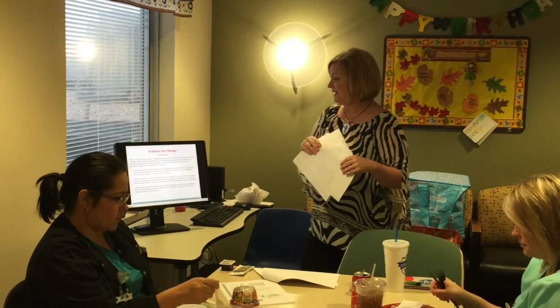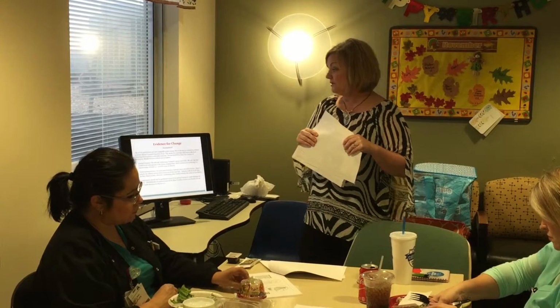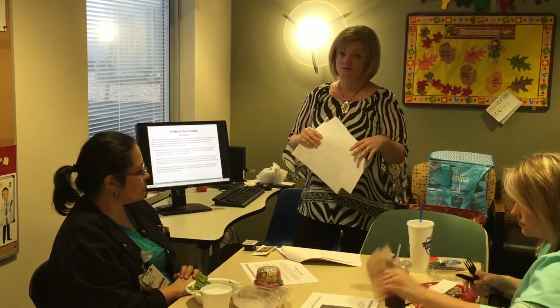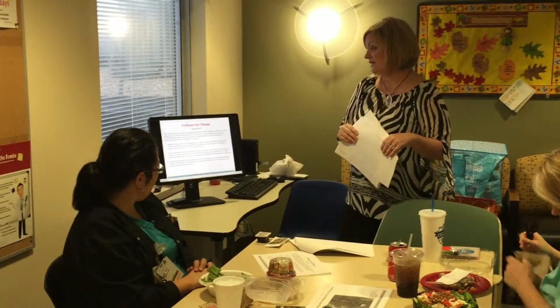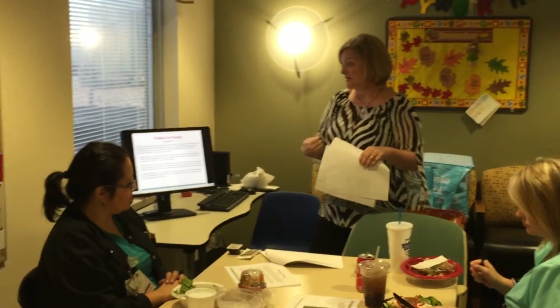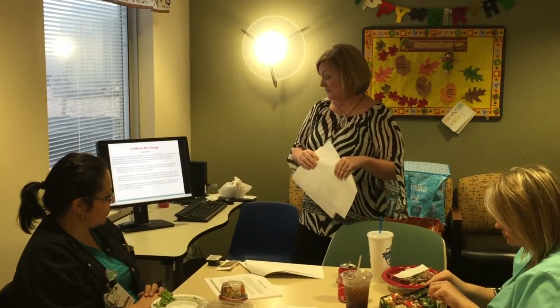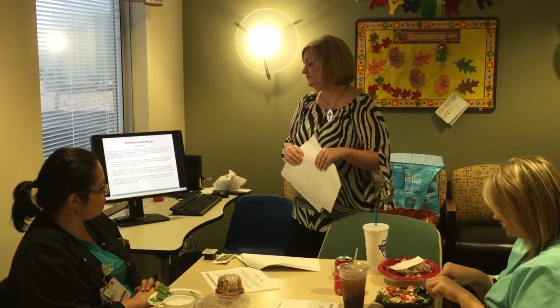So the first area of change for us as caregivers is the assessment. We're used to getting a manual blood pressure with a blood pressure cuff and a stethoscope. However, the patient doesn't have a pulse. So instead, you use a Doppler with the blood pressure cuff. And when you hear the first sound with the Doppler, that actually corresponds to the mean arterial pressure. So we're not getting a traditional blood pressure reading. Normal is between 60 and 90 millimeters of mercury, and anything over 90 is considered hypertensive.